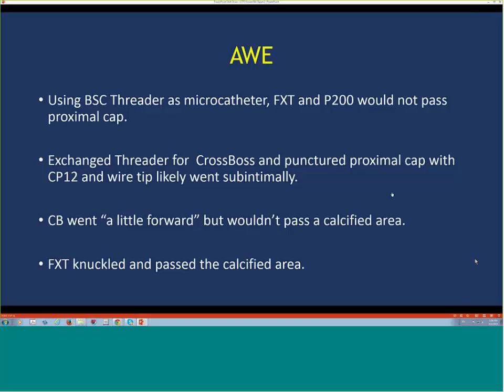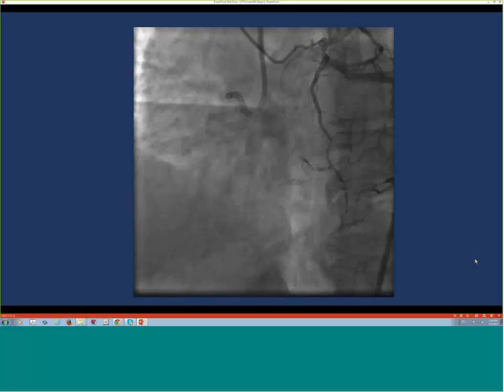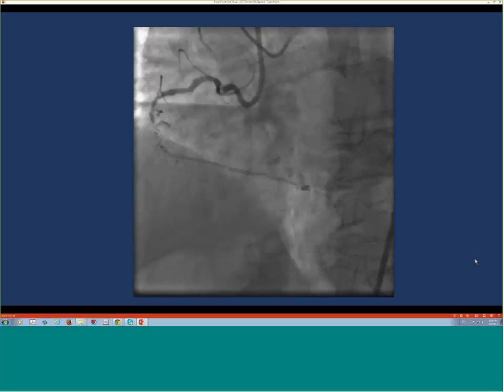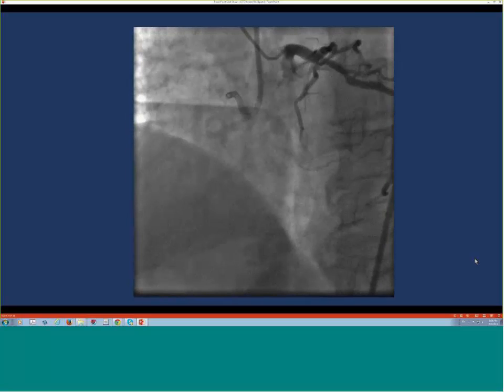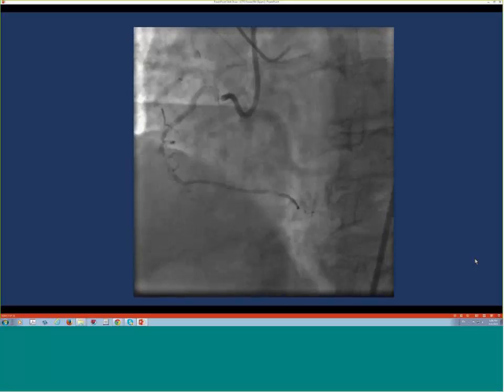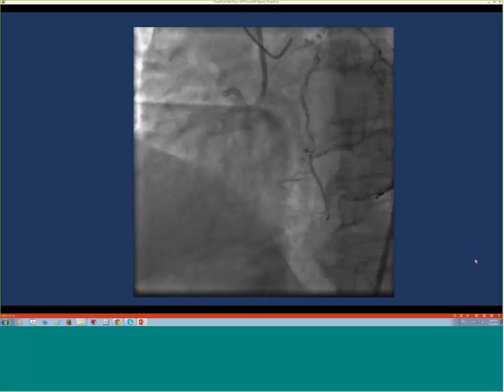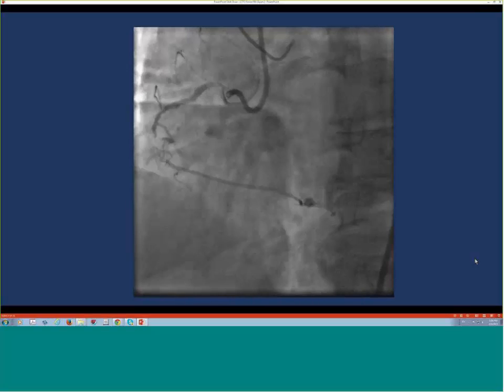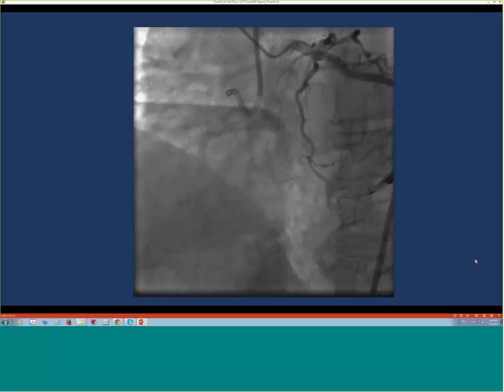And what was your experience with the Threader? We used it a few times as well, but what do you think? Well, it may not have been obvious on the angiogram, but the proximal part of the right coronary, and you'll take a look there, had a little bend in it. As the Threader went around distally, it kind of bent the catheter, and the catheter at the tip is a little bit like a Fine Cross, and it kind of crinkled up the catheter, so we had to pull the catheter back in order to get the guide wire through it, once we were exchanging guide wires. So I thought, this was the first case. It may have been a difficult case, but the thickness of the distal part of the catheter was so thin, it was not very impressive. So that's the only experience I have with it.